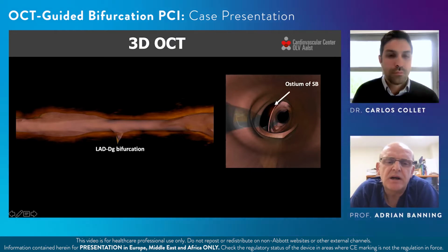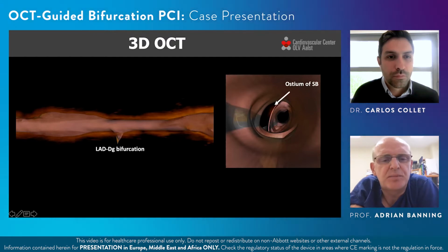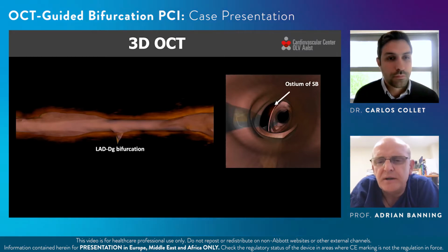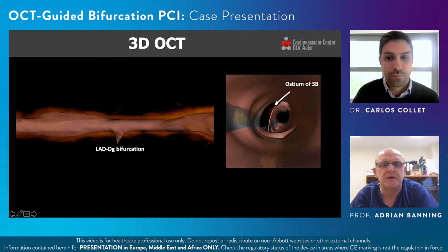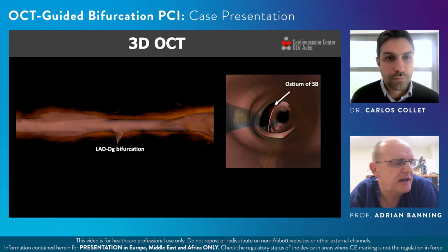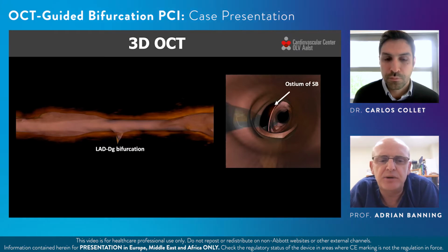Great. So, Carlos, you've heard the opinions of our colleagues there. I think broadly you have strong support for the approach with regard to imaging. And I think we all feel that if we can avoid putting further stents into this bifurcation, that would be preferable. I guess the fact that we think that based on the OCT, this may be a TAP or perhaps a T, more likely a TAP, possibly implies that wiring may be slightly more difficult. But let's see what you did.